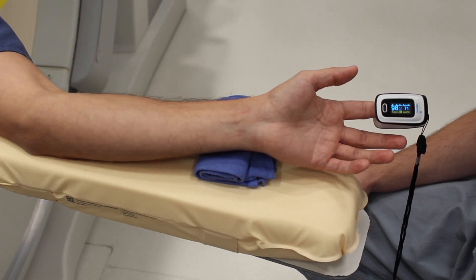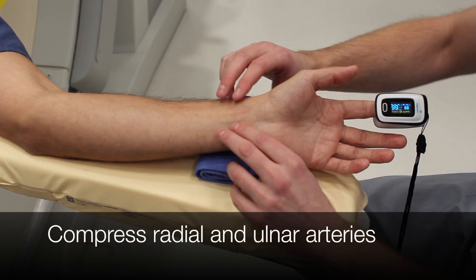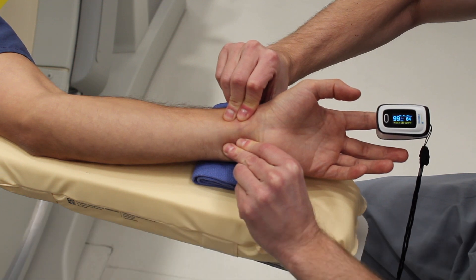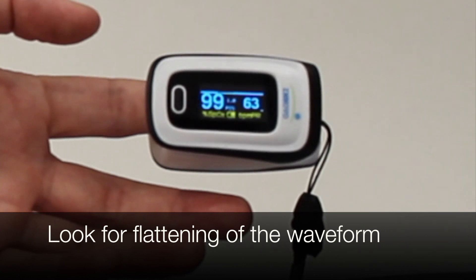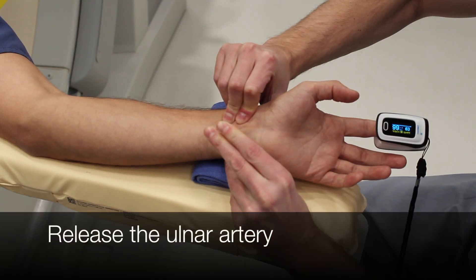To do the Barbeau test, compress the radial and ulnar artery at the same time. You're going to wait for a flattening of your waveform, which we see here. Let that flattened waveform run for about two cycles and then release the ulnar artery.